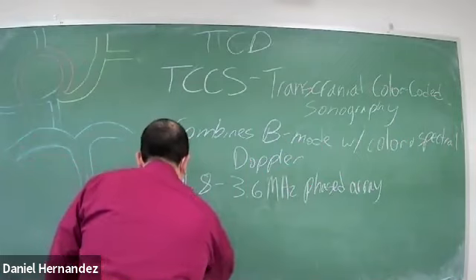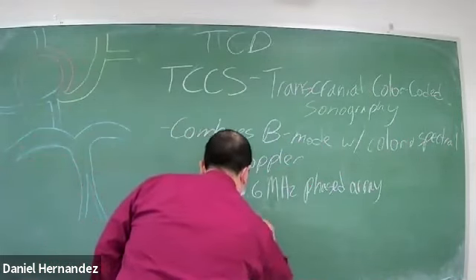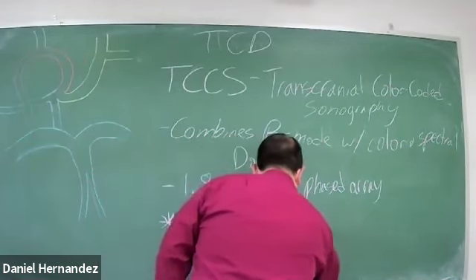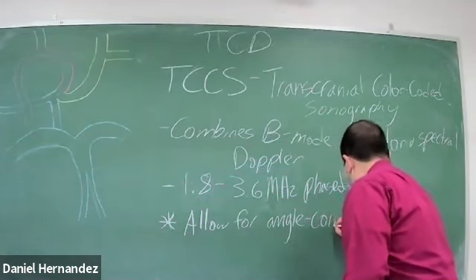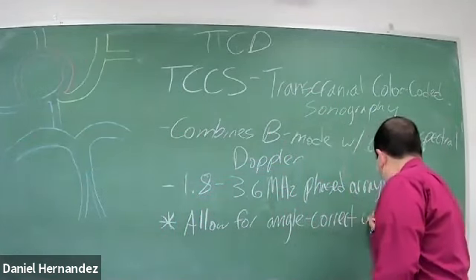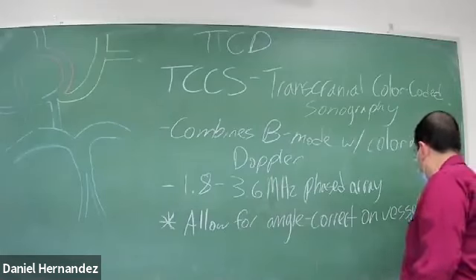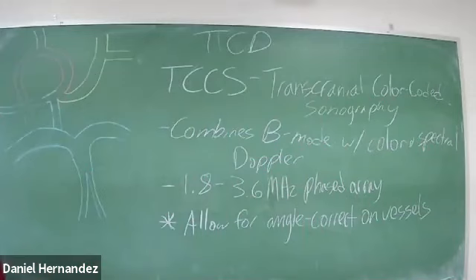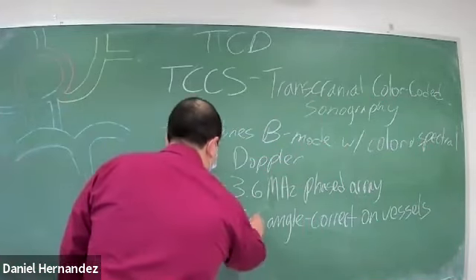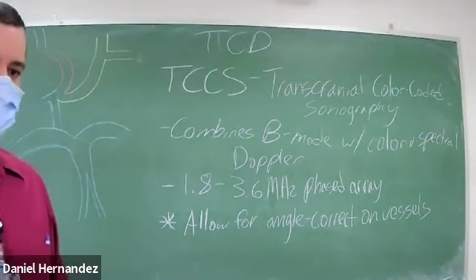What this allows for is angle correct vessels. With this one, we can angle correct and align ourselves parallel to the vessel, to get our proper Doppler angles.